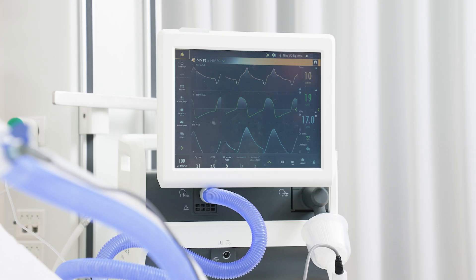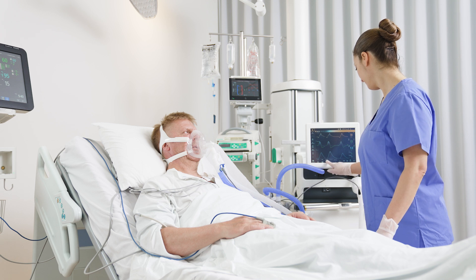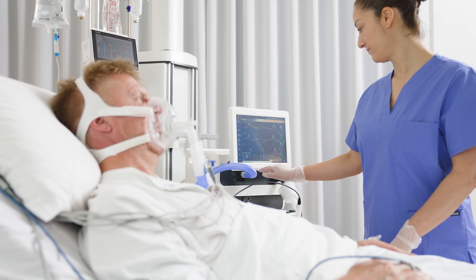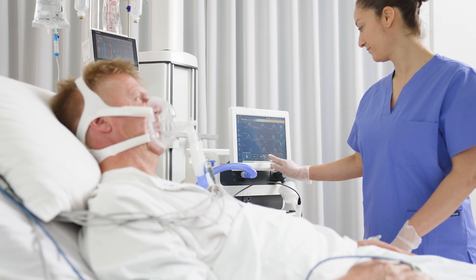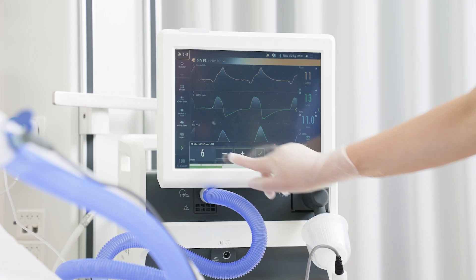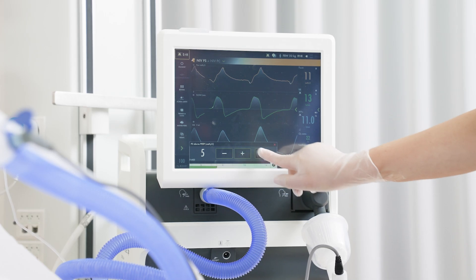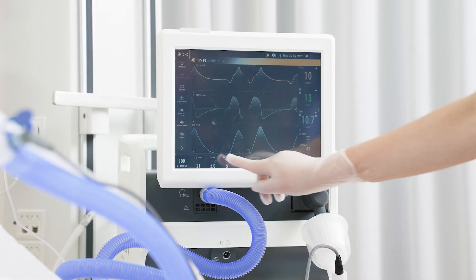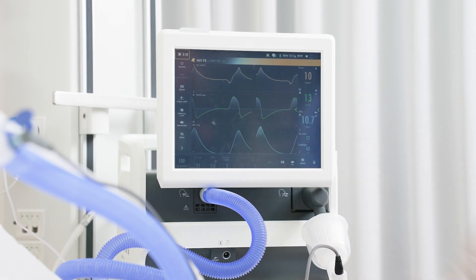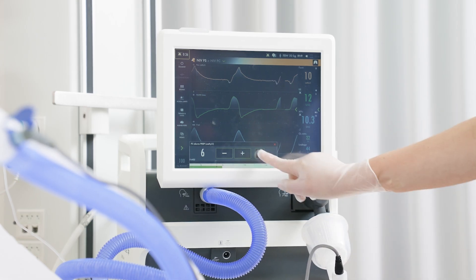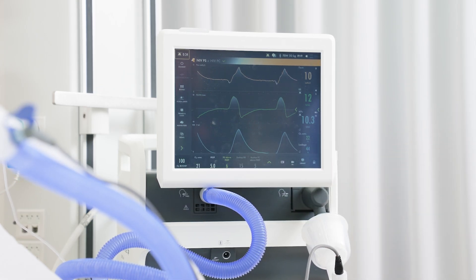The pressure supported breaths are triggered by the patient. The patient controls the respiratory rate and the ventilator delivers support using the preset pressure support above PEEP, or the delta pressure. Start with low PEEP and low pressure support levels above PEEP, giving the patient time to adapt and adjust accordingly.